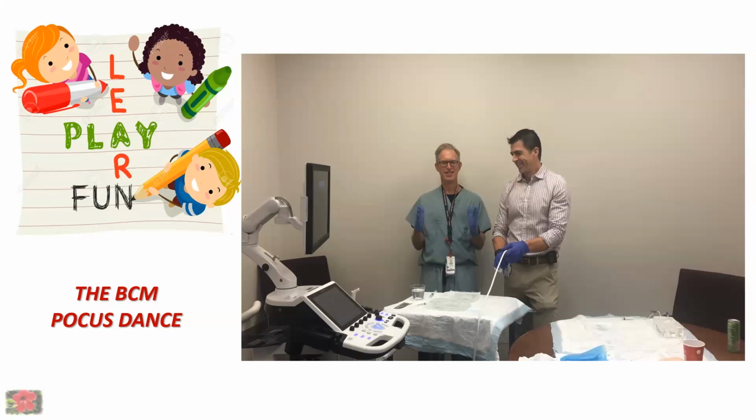We've used one from St. Louis Children's Hospital. The first go was just using Jello, and then the second one I found an agar mix from an anesthesia case report, and that's a little bit better. And for the actual vessels, I've used heat shrink tubing for wiring, and you can get it in small sizes for neonatology, down to I think 0.8 millimeters, which is pretty much similar to our very, very small ones.